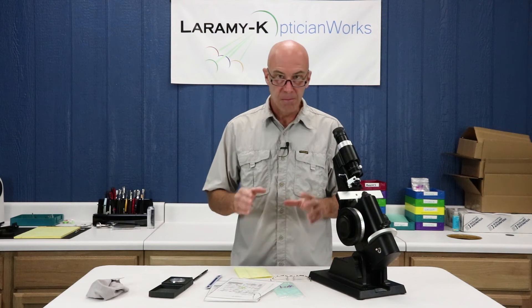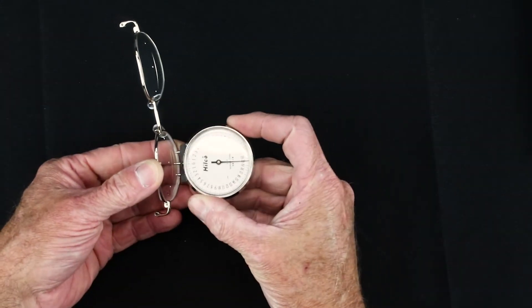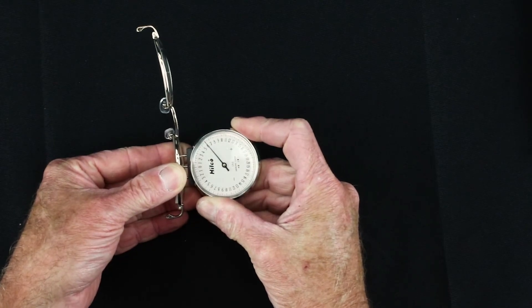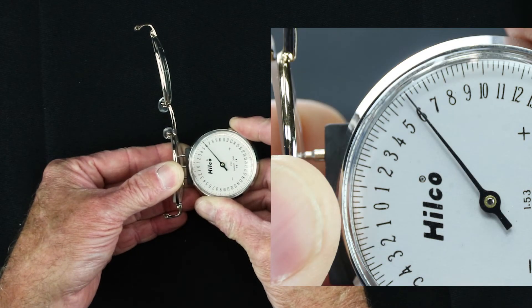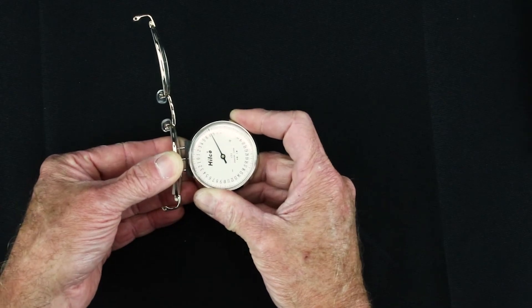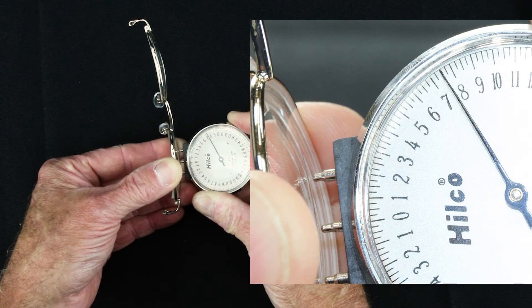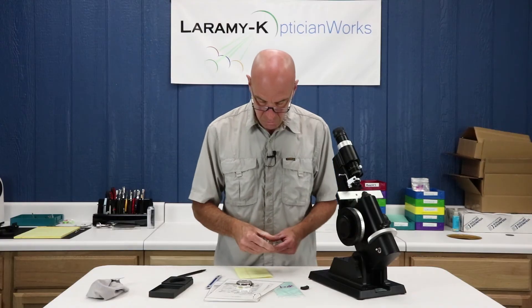The other and really far simpler way of checking a standard lined bifocal power is using your good old-fashioned lens clock. What you want to do is clock your front base curve — put your pin right on the white dot, hold it, read it — and I've got a beautiful plus 6.00. Then bring your clock down onto your segment, aim right for the middle of it, read the lens clock, and I've got exactly a plus 7.50. Lo and behold, I've got my plus 1.50.